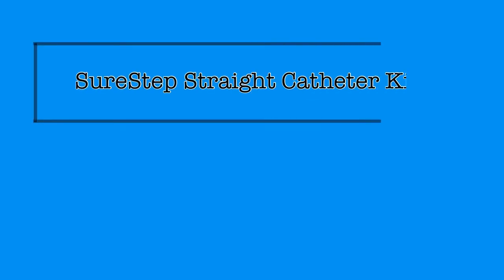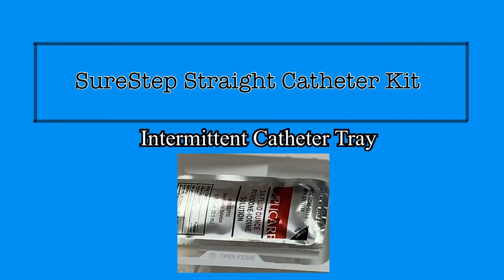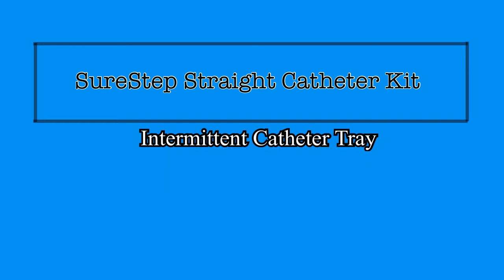The SureStep Intermittent Catheter Tray from BARD is designed to aid the practitioner in maintaining sterile technique during a straight catheterization by providing everything you will need in an organized space that is labeled with each step for insertion. The SureStep straight catheter is also connected to a drainage bag, making it a closed system, which is different from straight cath kits that have been used at St. Mary Mercy Hospital in the past.